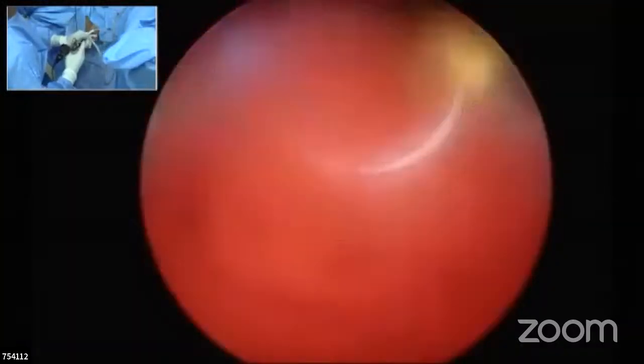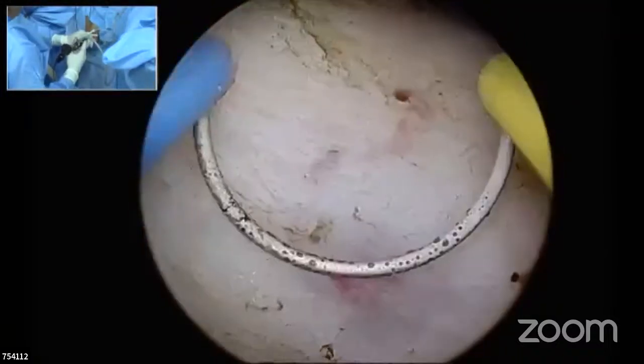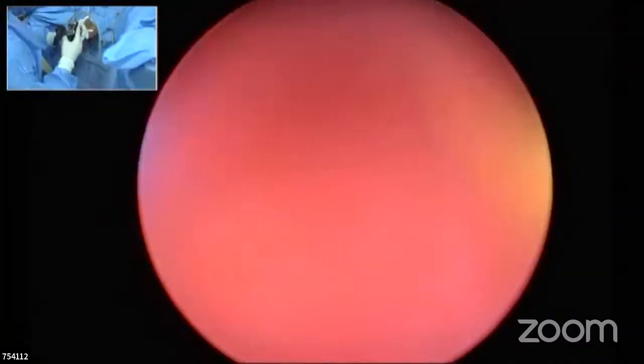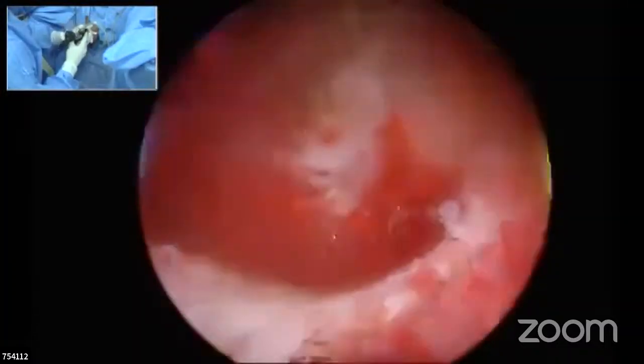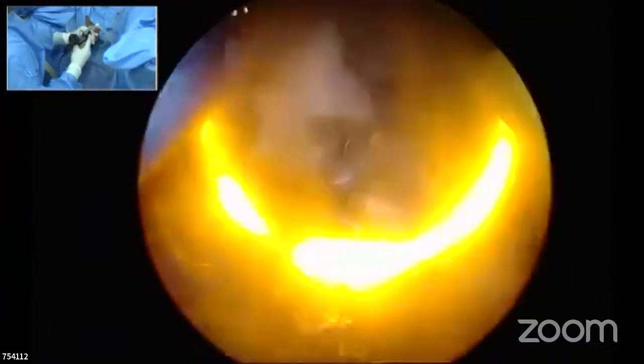With expertise, a urologist should be able to produce a specimen which is boat-shaped, using the entire depth and the length of the loop. That's the ideal resection. Yes. And that's what I was talking about.